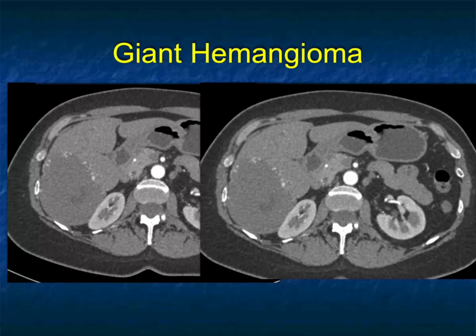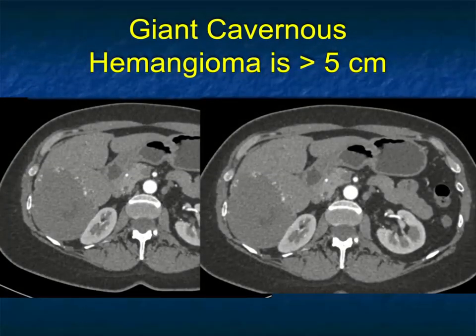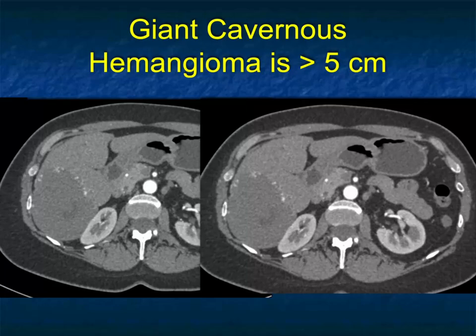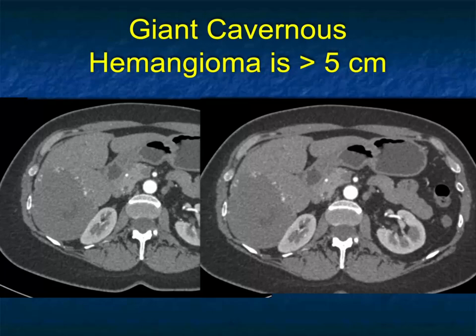In terms of describing hemangiomas, if a lesion reaches five centimeters, which is not uncommon, it's called a giant hemangioma. Looking at this first case, you see a lesion in the right lobe of the liver, and on arterial phase imaging you see peripheral enhancement — like a puddling — with some central scarring. You also notice the liver is not cirrhotic, which is important. Hemangiomas are essentially blood pool collections. When you have cirrhosis, hemangiomas will collapse and won't be visible. If you see a vascular lesion with peripheral enhancement in a patient with cirrhosis, to me that's hepatoma until proven otherwise.